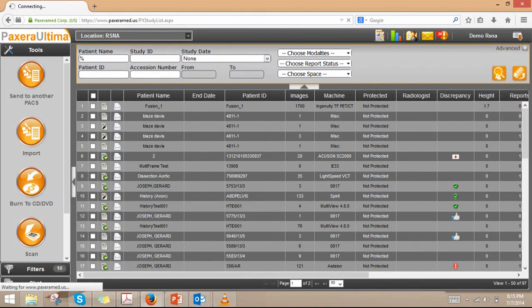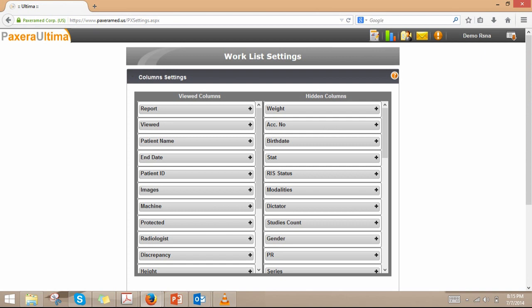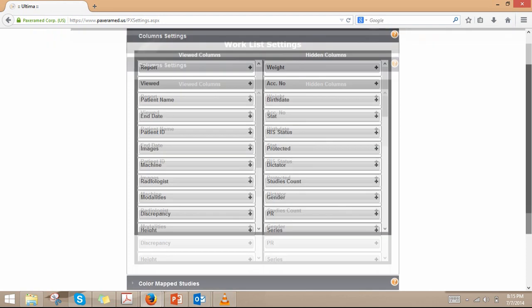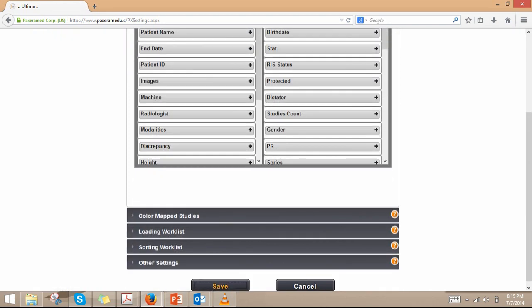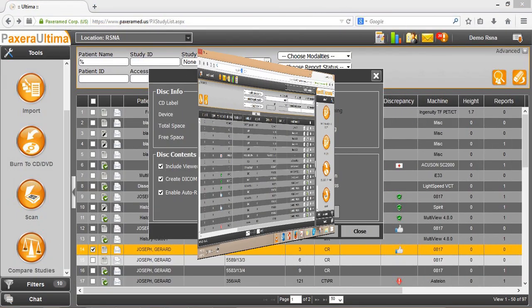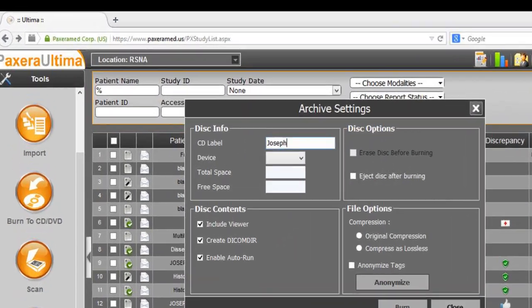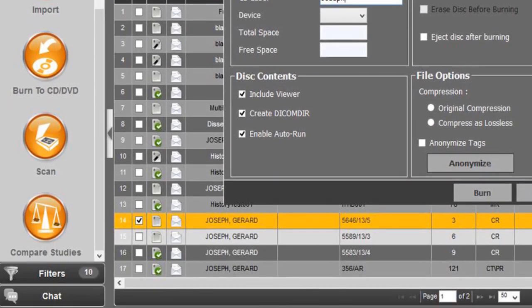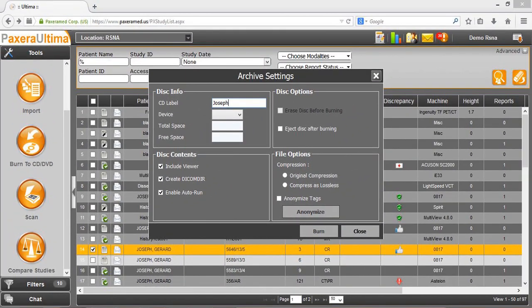Worklists are customizable. Columns can be added, removed, or renamed as per each user's preference. Frequently used tools are located on the sidebar to ensure frequent tasks are a click away. From the sidebar, users can select tasks such as importing studies from different media, archiving studies onto a DVD, or comparing two or more studies.